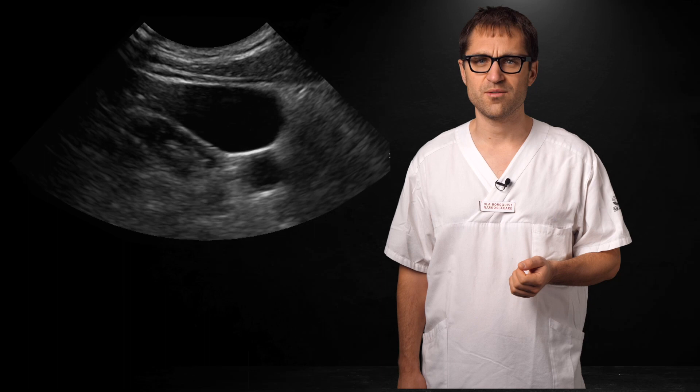The artery can often be identified just by eyeballing. Due to the higher pressure, it's rounder, has a thicker wall and bulges with every heartbeat. It's not as easily compressed compared to the vein. The arterial flow is pulsatile, but be careful with this — the vein may sometimes seem to be pulsating due to the proximity to the artery.